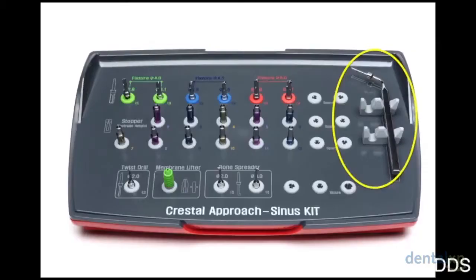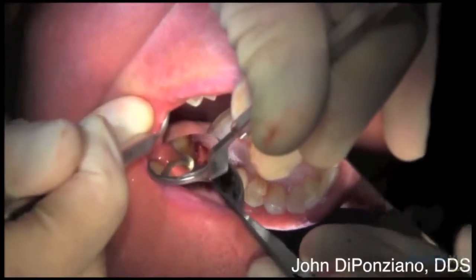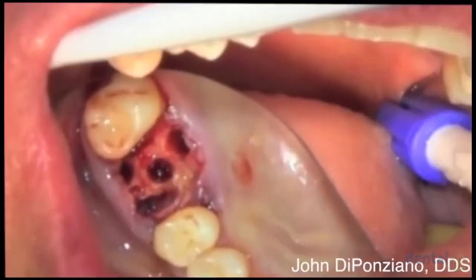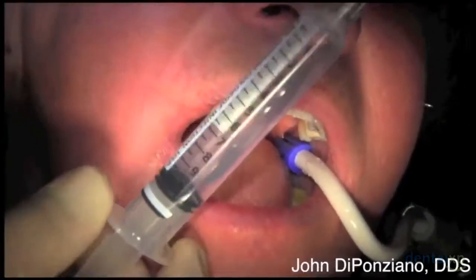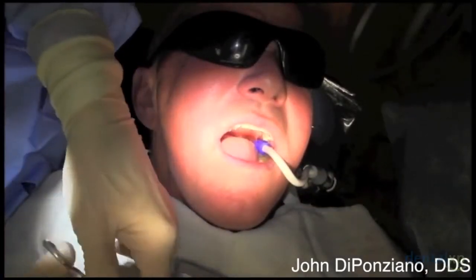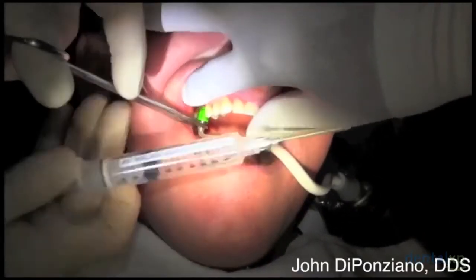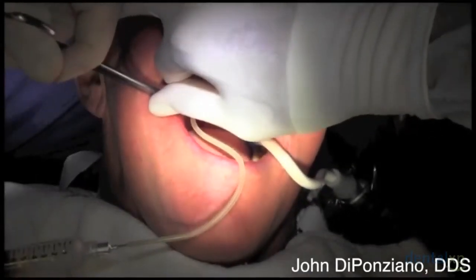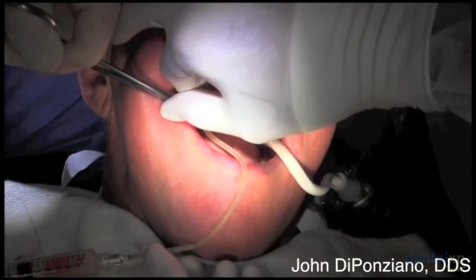Now I can feel that I've gotten through. I pick up the depth gauge and feel a little sponginess — a trampoline effect — so I know I'm up against the membrane. You can see the bleeding because I'm actually through, but I haven't perforated the membrane; I can feel I'm through the bone. Now I'll use the membrane lifter, which is an autoclavable silicone tip attached to a saline syringe. It seals into the osteotomy, the assistant stabilizes it, and then using 0.5 cc increments I inject upward to raise the sinus membrane.